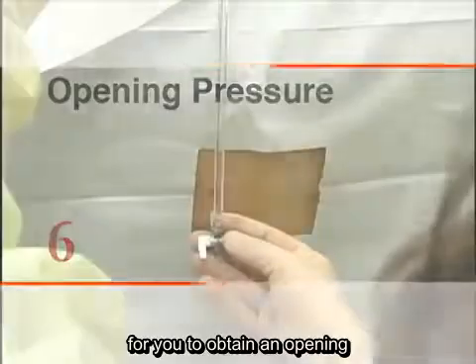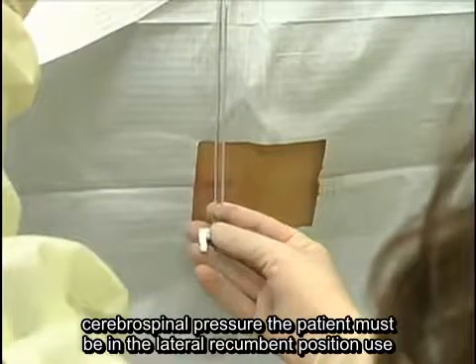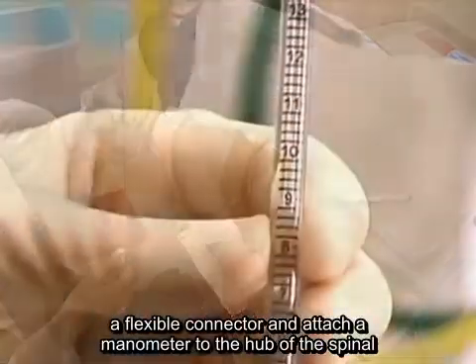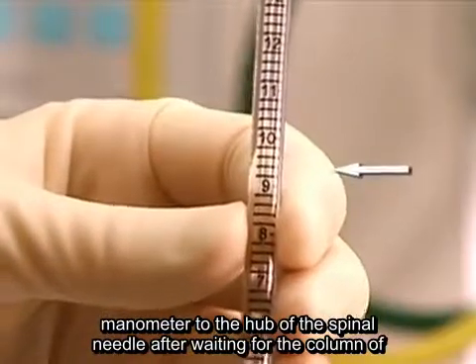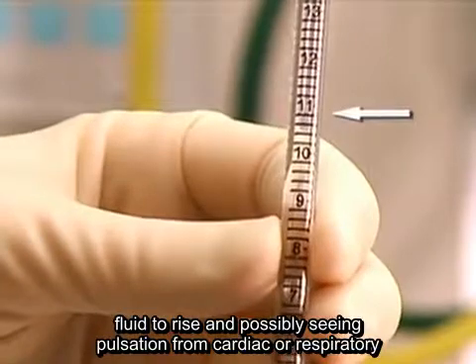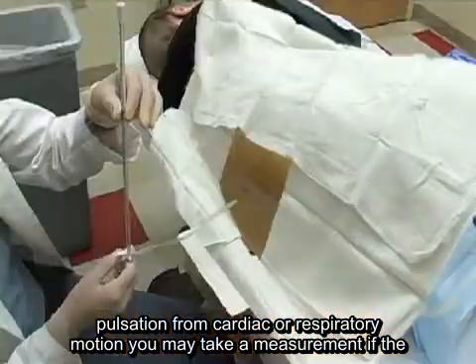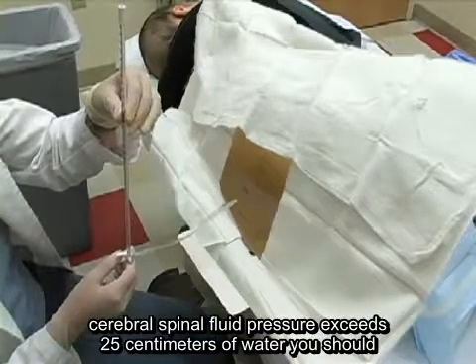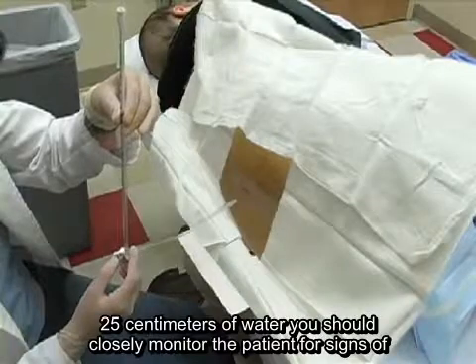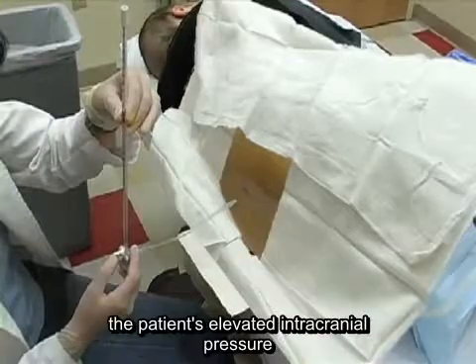For you to obtain an opening cerebrospinal pressure, the patient must be in the lateral recumbent position. Use a flexible connector and attach a manometer to the hub of the spinal needle. After waiting for the column of fluid to rise and possibly seeing pulsation from cardiac or respiratory motion, you may take a measurement. If the cerebrospinal fluid pressure exceeds 25 centimeters of water, you should closely monitor the patient for signs of herniation and determine the cause of the patient's elevated intracranial pressure.